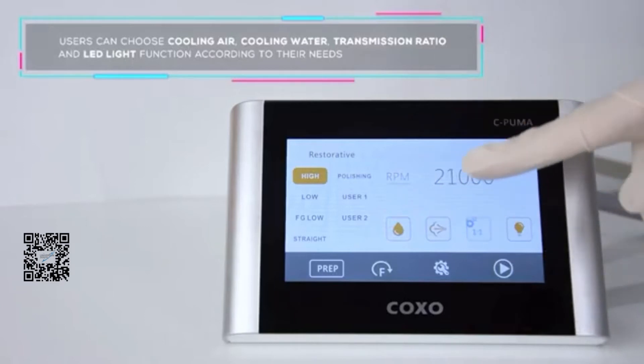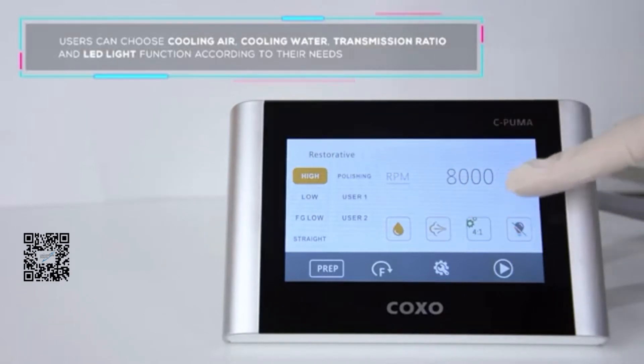Users can choose cooling air, cooling water, transmission ratio, and LED light function according to their needs.